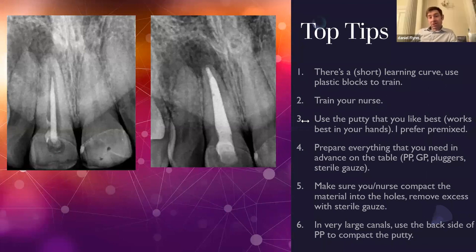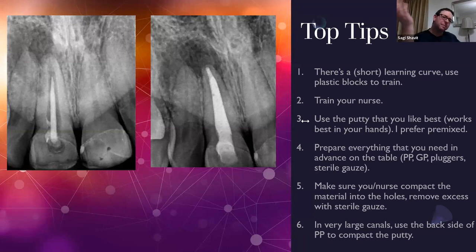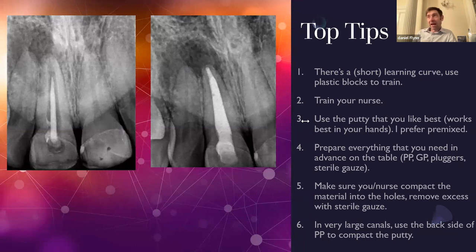No, I don't use that. I just use hypochlorite, and I do use EDTA, and it's on feel. I do some of them in a single visit. But the last one I did that failed, I did in a single visit and it didn't work. So it's about controlling infection. In these cases you get down to length, you don't even need to instrument, you've used ultrasonic irrigation, it looks so clean, and you're thinking, how am I ever going to get it cleaner than this?